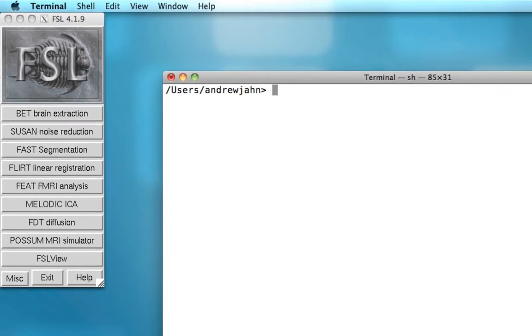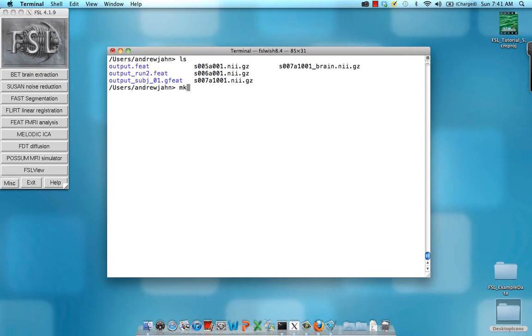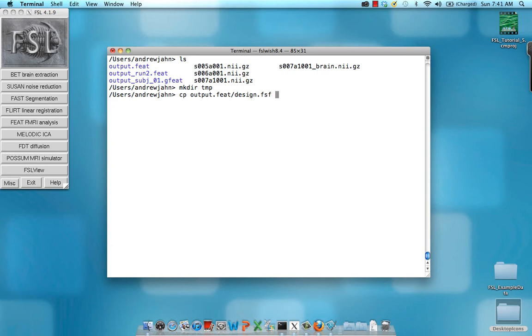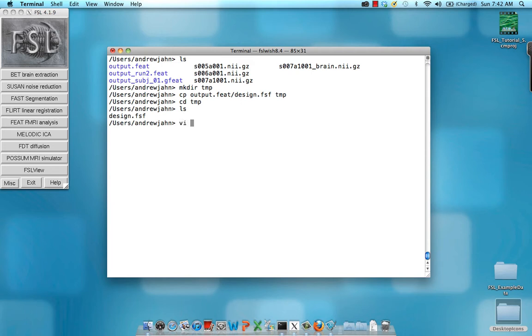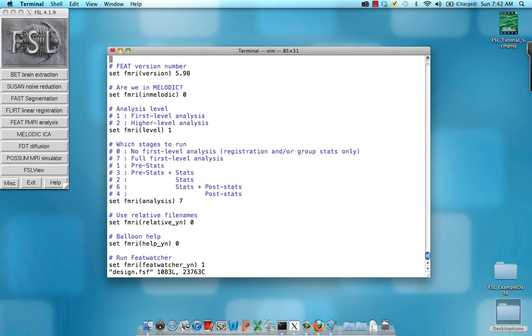So what I'm going to do, I'm going to create a directory called temp in here, and I'm going to copy that design.fsf file into this temporary directory. With this design.fsf file, I'm going to open it up briefly, just take a look at it.